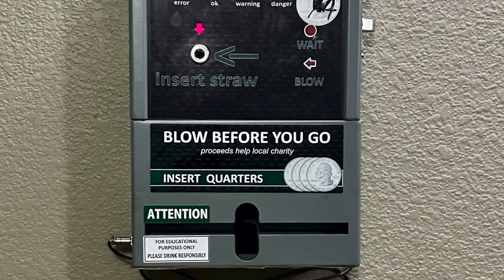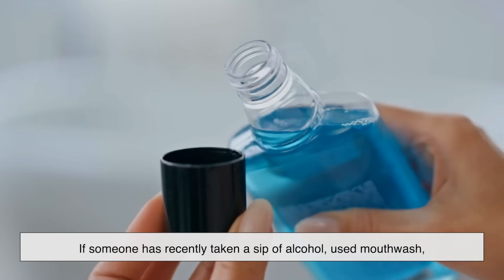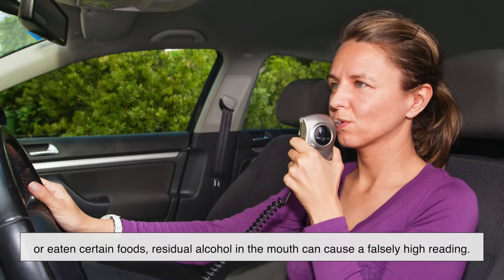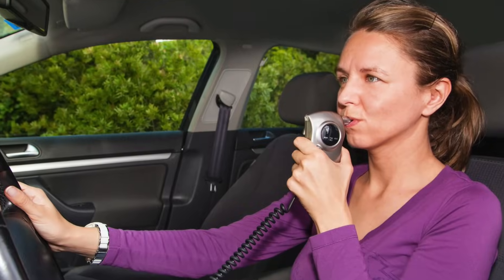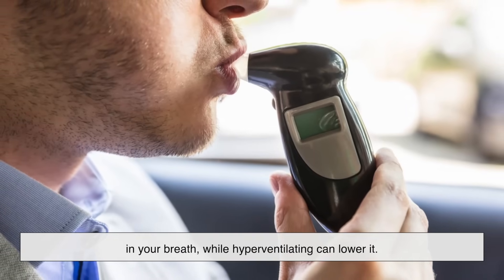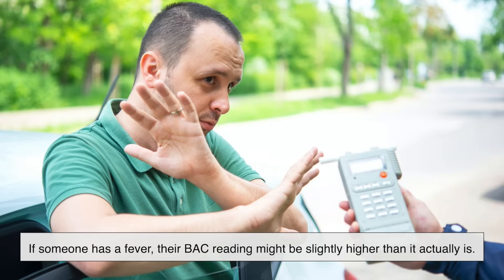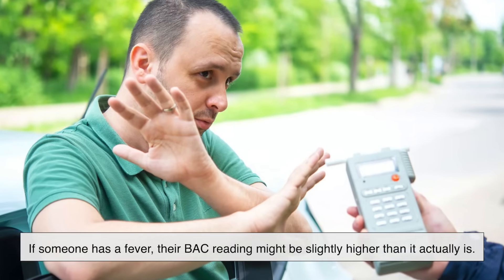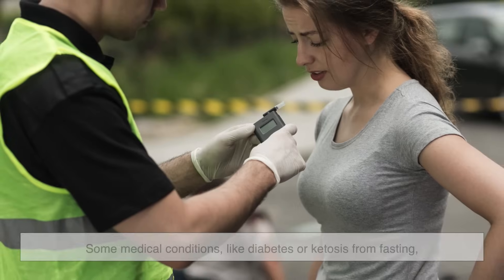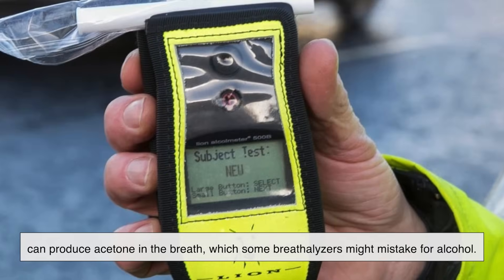While breathalyzers are useful, they aren't perfect. Several factors can influence accuracy. Mouth alcohol — from a recent sip of alcohol, mouthwash, or certain foods — can cause a falsely high reading. Breathing pattern also matters: holding your breath before blowing can increase alcohol concentration, while hyperventilating can lower it. Temperature is another factor — breathalyzers are calibrated for normal body temperature, so a fever can cause a slightly elevated reading. Additionally, some medical conditions like diabetes or ketosis from fasting can produce acetone in the breath, which some breathalyzers might mistake for alcohol.